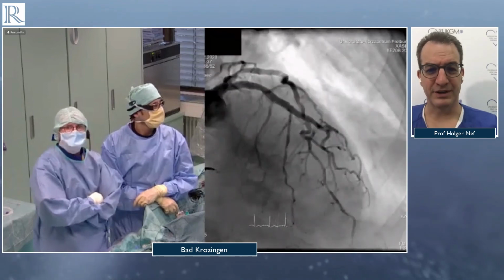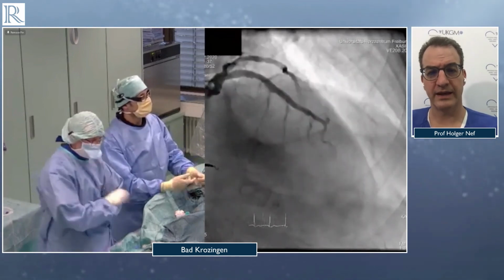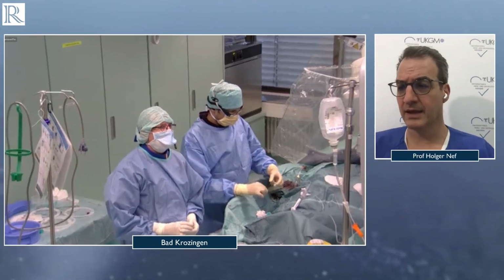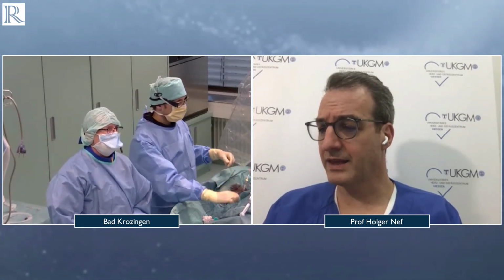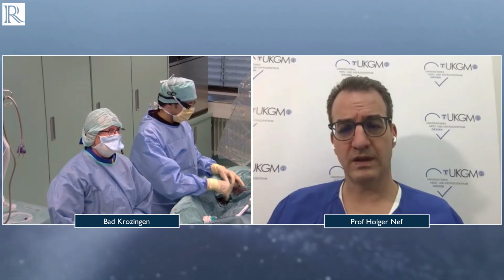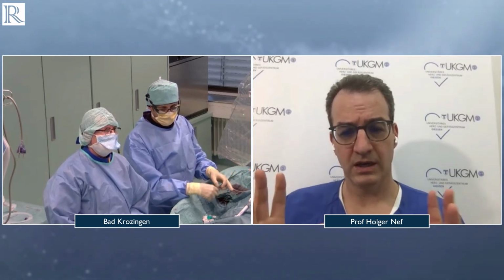Thank you, Campus, for this terrific case, and it shows how experienced you are in these kinds of calcified complex lesions, and they are always very difficult to tackle. And you guys managed that brilliantly. So there are actually some questions from the audience, and I think the first question which we should discuss, and we should make that very clear: what is your strategy to decide either IVL or rotational atherectomy? Which kind of strategy do you have to go for the one or for the other device?